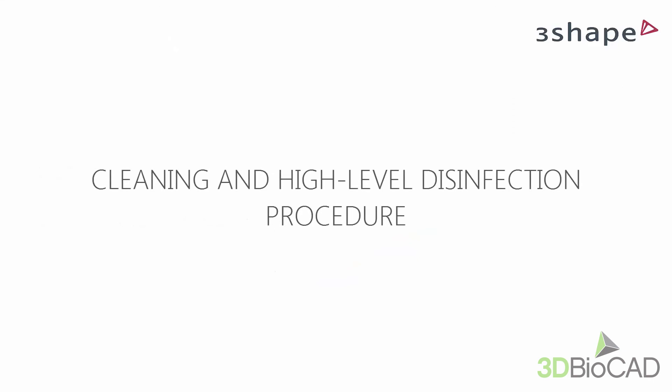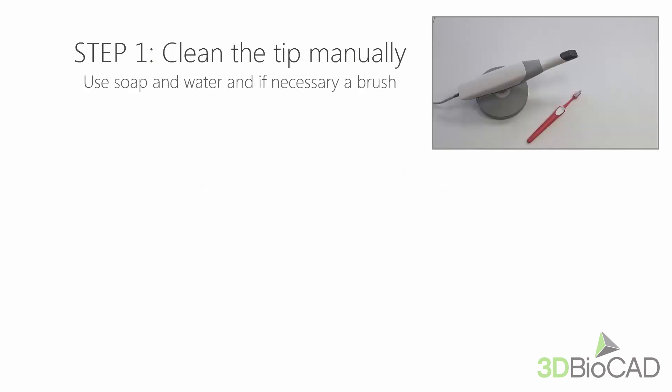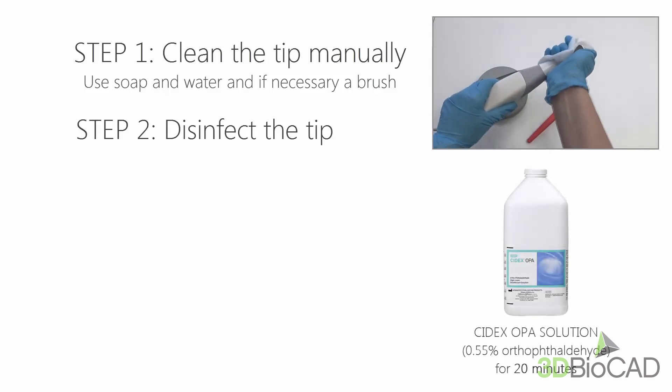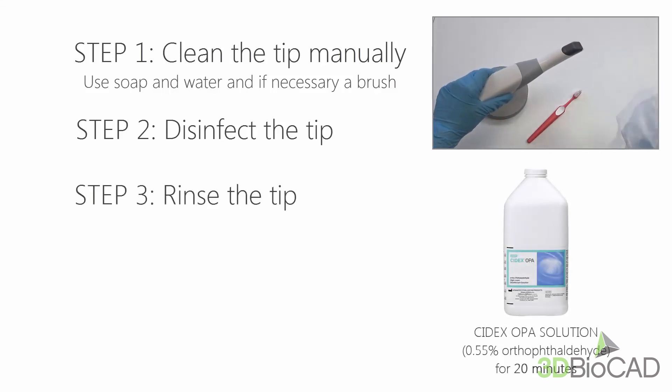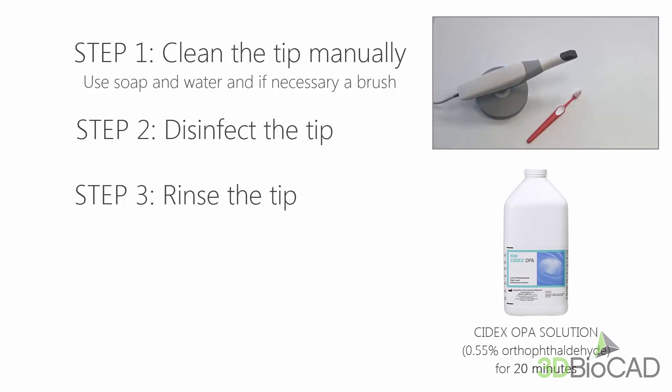If sterilization is not feasible, use high-level disinfection with a high-level disinfectant. The procedure is almost the same as before. First, clean the tip manually, then disinfect the tip using Cidex OPA Solution for at least 20 minutes. After the tip has been immersed in the disinfectant, remove it and rinse it according to the Cidex OPA Solution instructions for use. When done, use a sterile and non-abrasive paper towel to dry the tip. Now you can insert it into the scanner and start scanning.